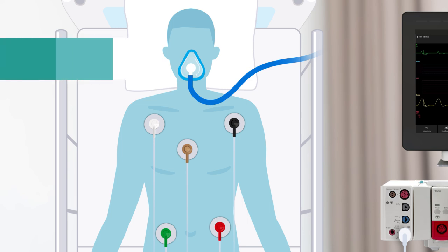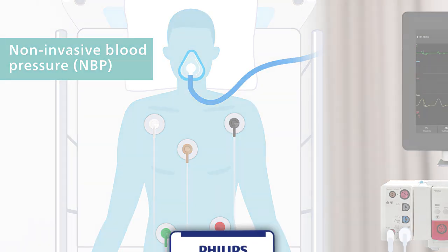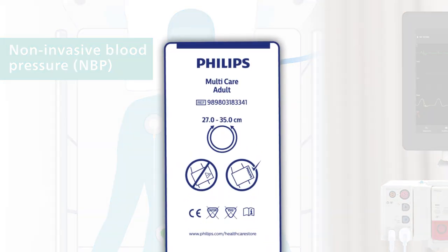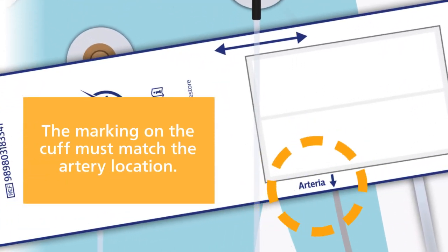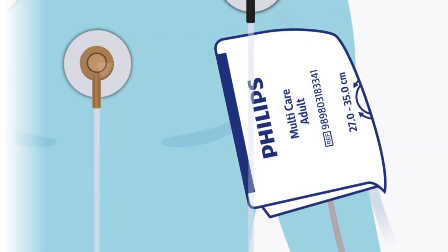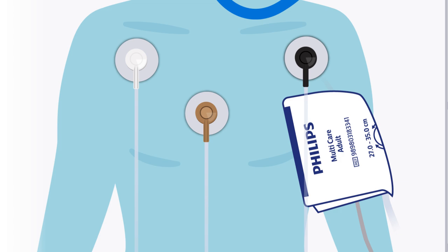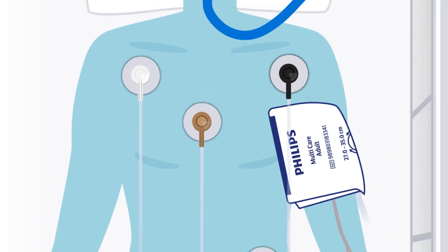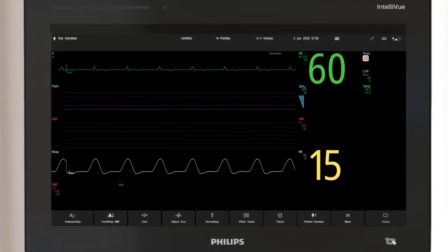IntelliView monitors use the oscillometric method for measuring non-invasive blood pressure, or NBP. Be sure to select the proper cuff size before positioning the cuff around the limb. When wrapping the cuff snugly around the patient's limb, ensure that the index edge falls within the range indicated by the range arrow. Try to apply the cuff to a limb at the same level as the heart, and ensure tubing is not kinked or twisted to ensure an accurate measurement. With the NBP cuff in place, you can start NBP measurement by selecting the smart key.